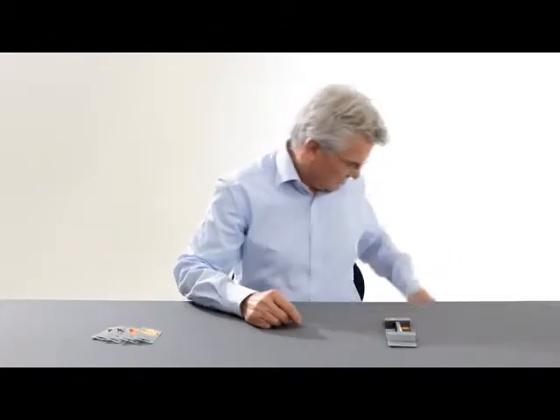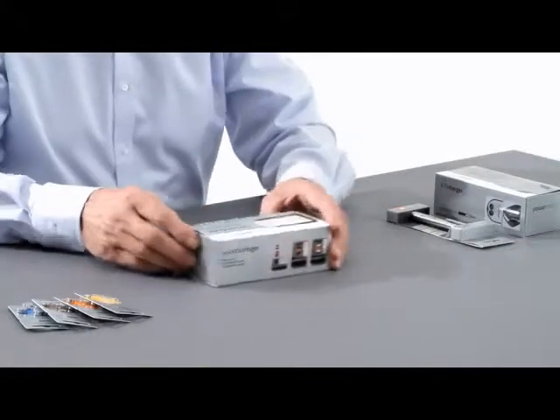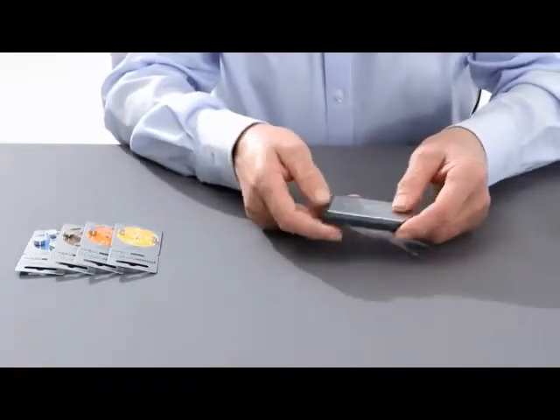We offer you three different chargers for recharging your battery. This, for example, is the Power One Pocket charger. It is small and flat. It enables you to charge up to two batteries at the same time.